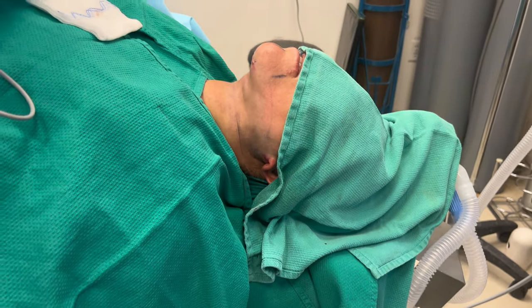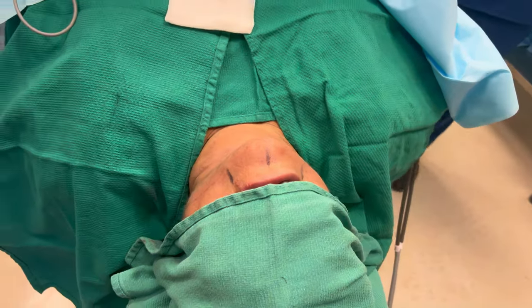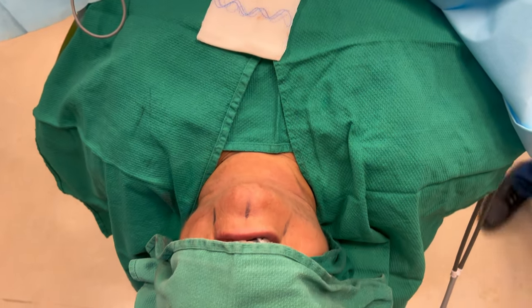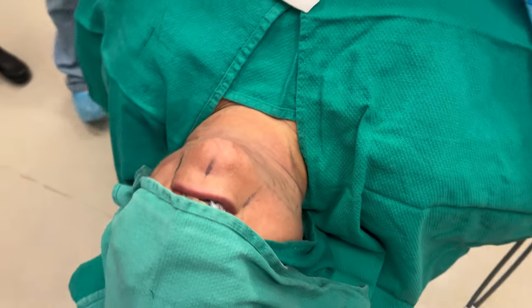We are done with the neck lipo and subplatysmal dissection. We've reshaped the neck — we did not remove any skin. There's going to be a little bit of bruising, but the neck is going to look so much better.